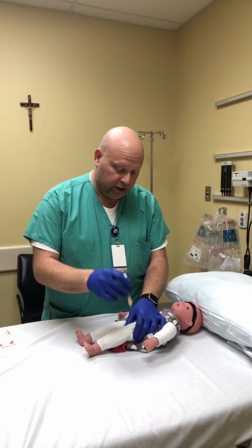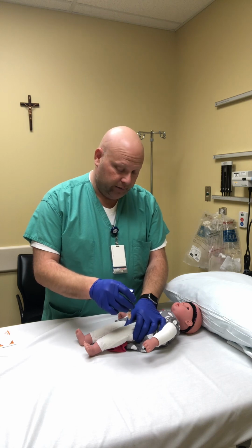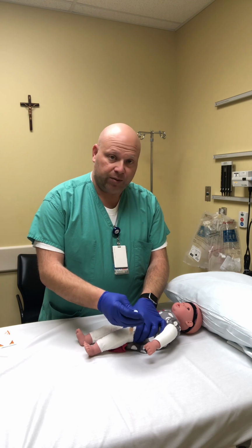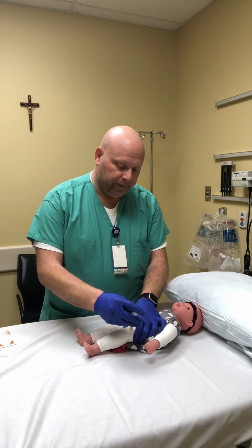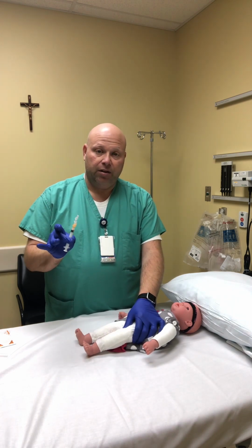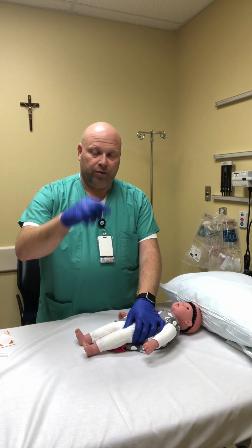So with this IM injection, I'm going to go straight in at a 90-degree angle, all in one motion here on the vastus, here on the side, boom. I'm going to aspirate a little bit, make sure that there's no blood. I'm going to give the injection, pull straight out. I'm going to engage my safety mechanism. I'm going to throw it in the sharps.